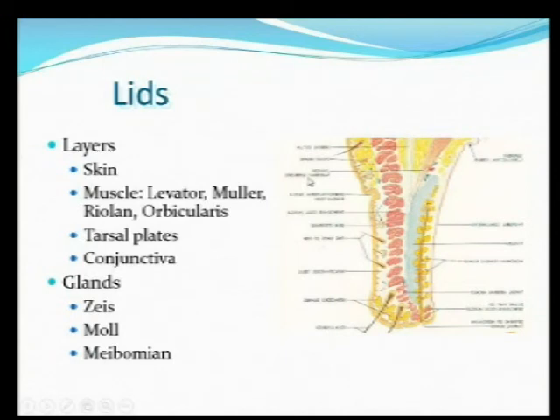Where it comes into play with contact lenses is that sometimes we need to look at the inside lining of the lid or the palpebral conjunctiva. And so that requires flipping the lid. And to flip the lid, it doesn't bend anywhere within the tarsus.